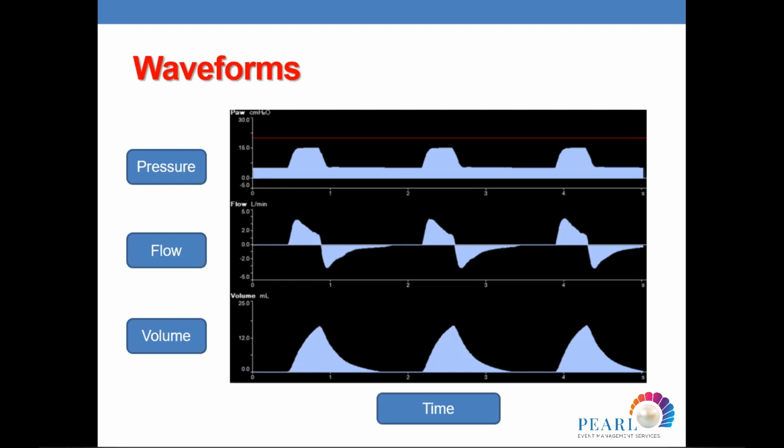The area under the curve in both, meaning the inspiratory tidal volume and the expiratory tidal volume, should be equal. Then the volume will start at 0, and at the time the inspiration stops, then expiration. So it is always positive.